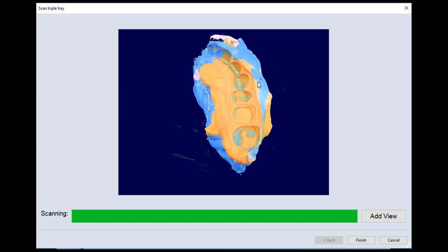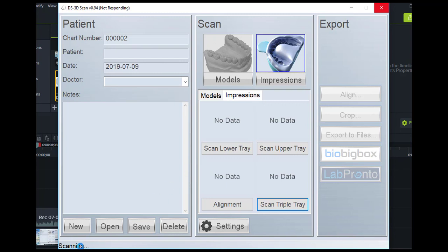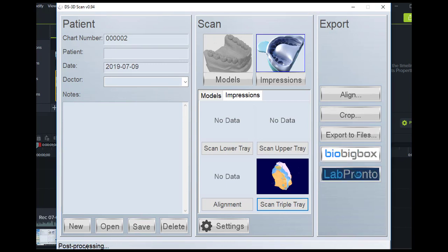If you shorten the vestibular area right here, that lets more light get into this scanner. So with that done, I'm going to click Finish. The software is going to take us back to the main software page, and with this done, you're going to see in the bottom left-hand corner an update that's telling us that it's finishing up the scanning process and now it's post-processing. And as soon as that finishes, then we can click on the crop function to crop our models down.